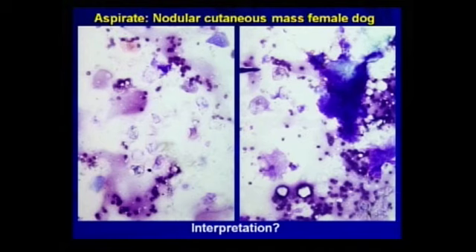Well, this is a nodular mass from a dog. Site is somewhat immaterial. And this slide is an absolute mess. Okay? It's very blue. It's got keratin all over it. But the question to you is, what are these structures? And these will help you make the diagnosis. And then they really show up nicely in the areas where you have a lot of liquid.